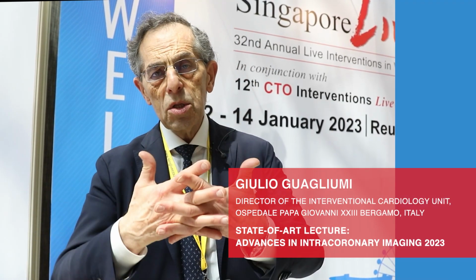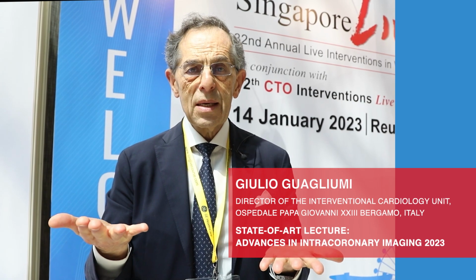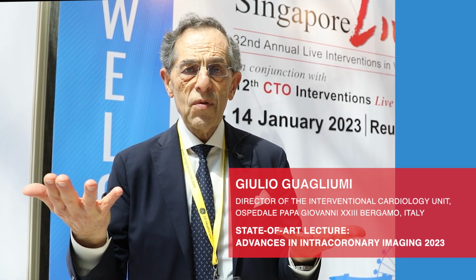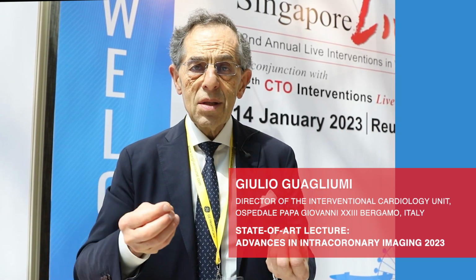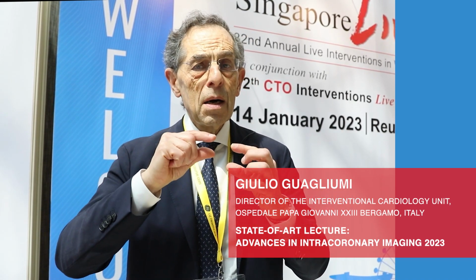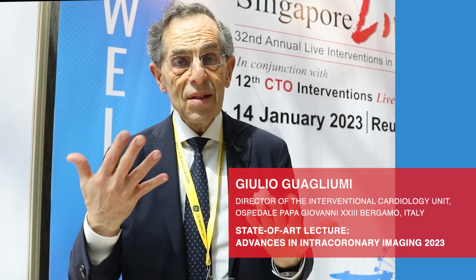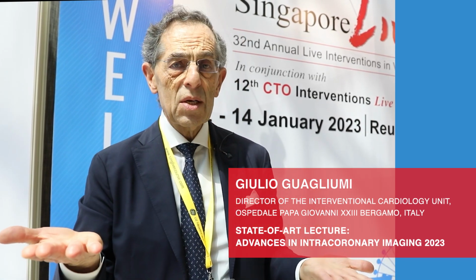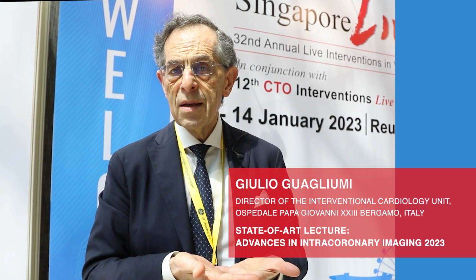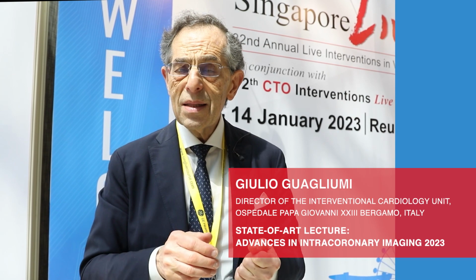One of the live cases where IVUS and OCT are going to be simultaneously acquired and simultaneously displayed. This is increasing the amount of information. The challenge is that the imaging catheter, when combined, becomes a little bit bigger, and that could be an additional point of challenge when we are dealing with a complex patient like what we deal with every day. So it's a point of refinement, a point of bringing the data.